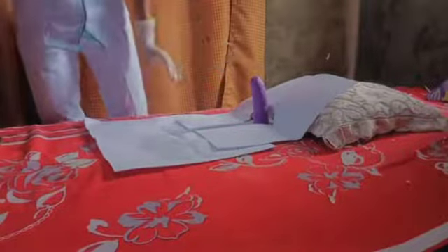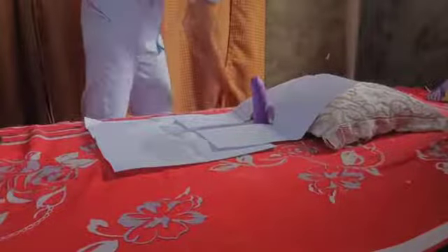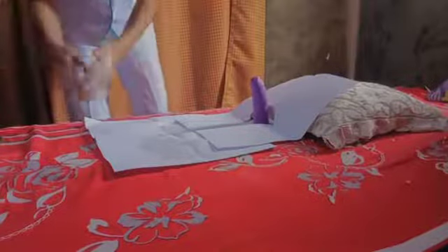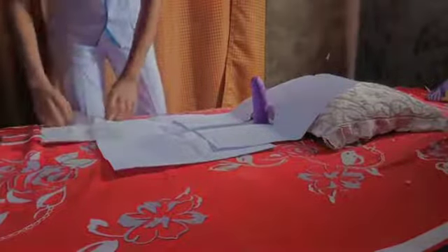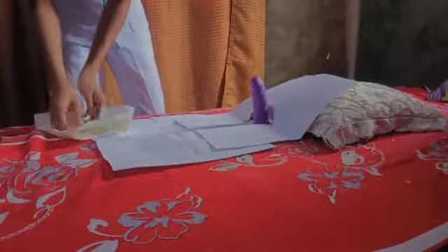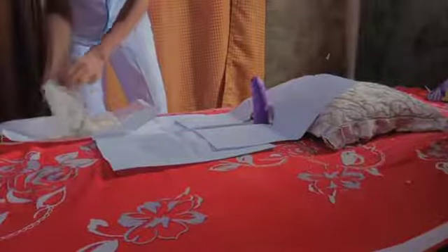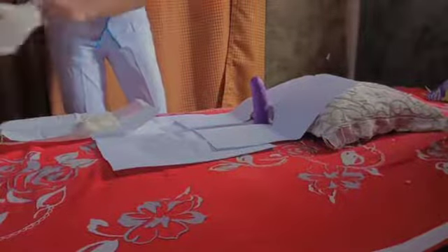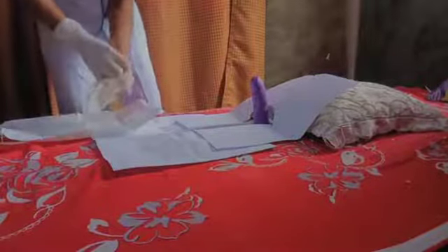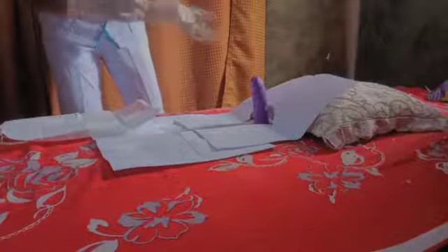After that, I will remove my gloves and put on another set of sterile gloves to maintain sterility — first for the dominant hand, then for the non-dominant hand.